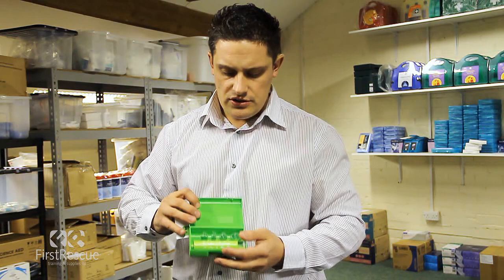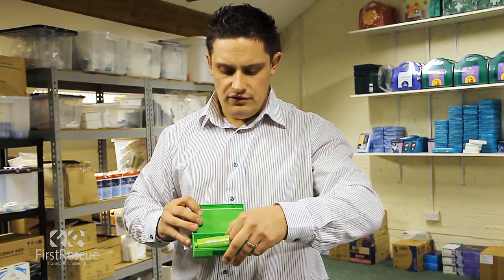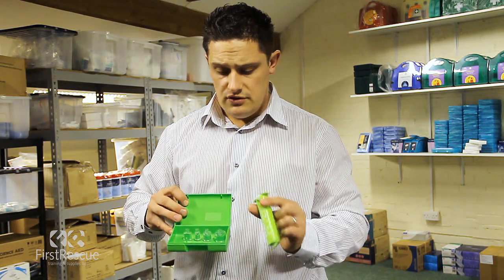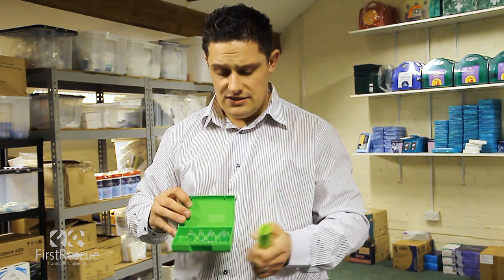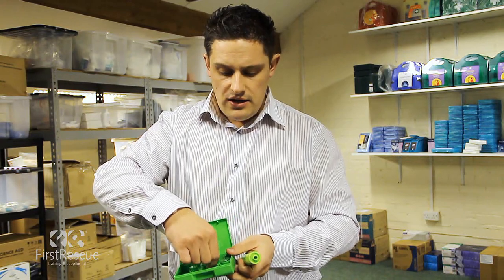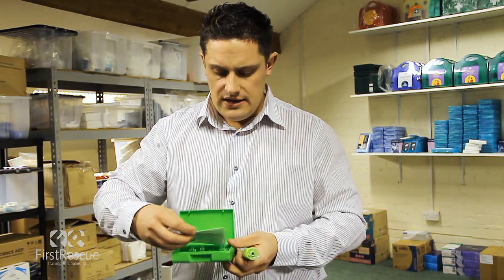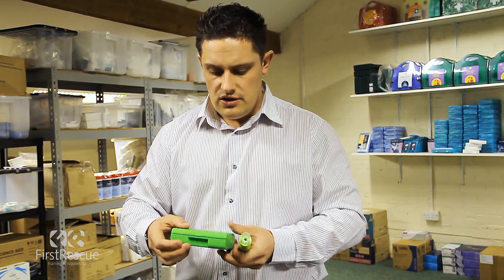Also inside the box, we have the vacuum pump itself and four different attachment nozzles for different types of bites and stings. Today we are going to use a medium sized nozzle and demonstrate this product in use.